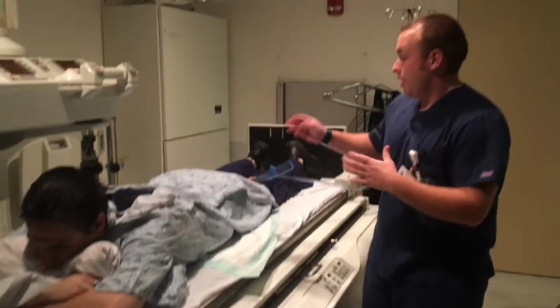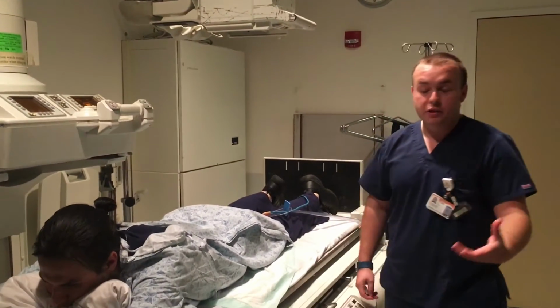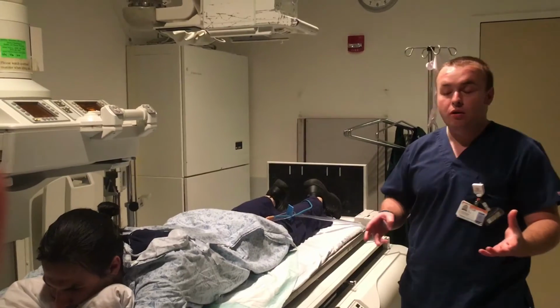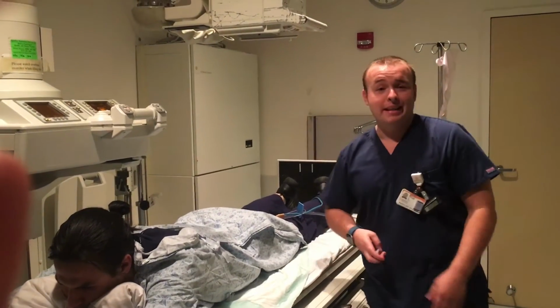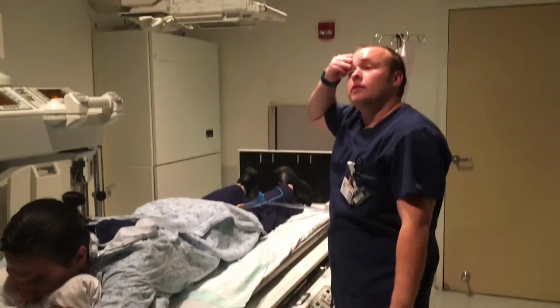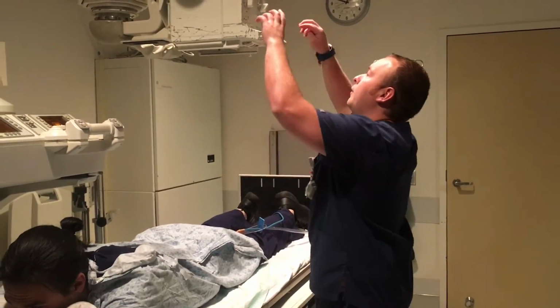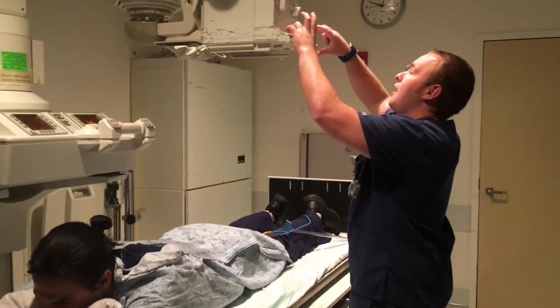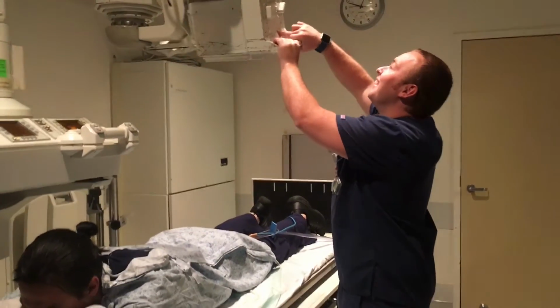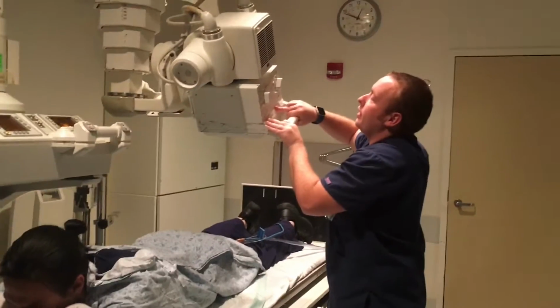This film image, we're going to do a 10x14. You can use a 14x17, it just depends on your protocol. I'm actually going to go 14x17 just because. We're going to do the PA axial of the rectum, and we're going to go 30 to 40 degrees caudad. I'm going to go 30 because this guy, he's pretty thin.